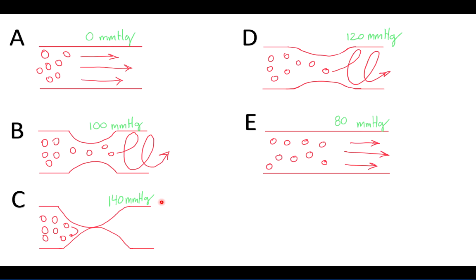Let's go ahead and start releasing the cuff pressure, 2 to 3 millimeters of mercury per second. And at some point, this vessel wall is going to begin to open up. As it does so, the first of our red blood cells are going to sneak through. And again, in this turbulent blood flow, they're going to knock around or bang around on the interior vessel wall. This creates our first Korotkov sound.